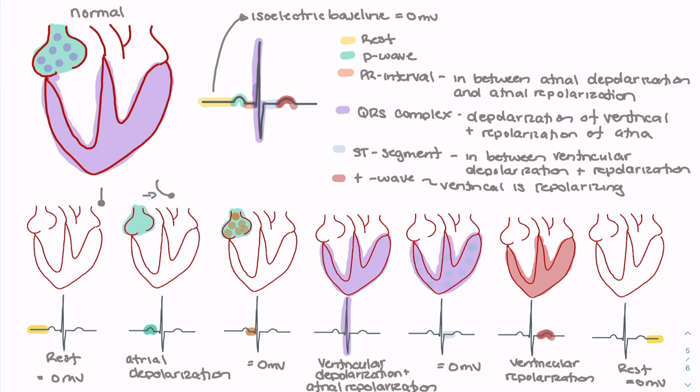And then when we get to this rest period, we're waiting for depolarization, we've hit that kind of apex and we're waiting for it to come back down. So again, this period is indicative of complete rest. This period is showing us that we have movement, and here is the change in direction. So we've swung the pendulum up, it's no longer moving, it's right at that apex and it's switching direction and coming back down. So we'll use this understanding of the normal function of the heart to then talk about why we see ST elevation on the 12-lead ECG for someone who's having a transmural myocardial infarction.